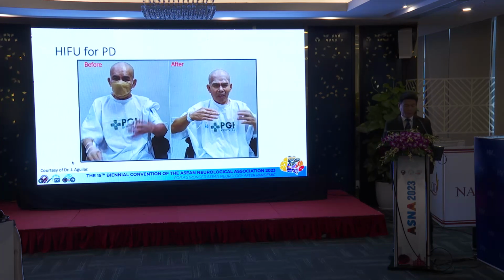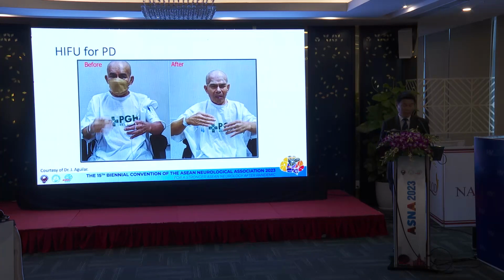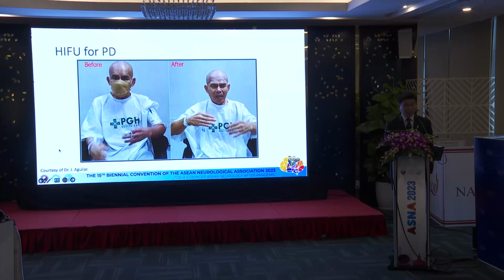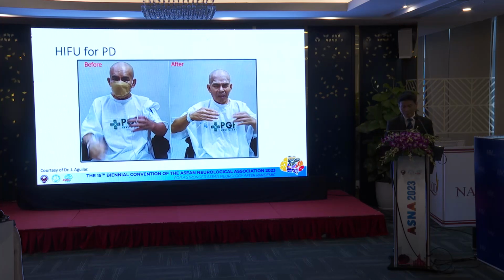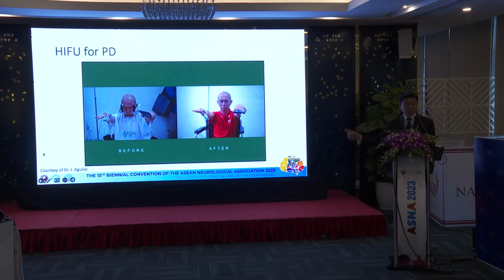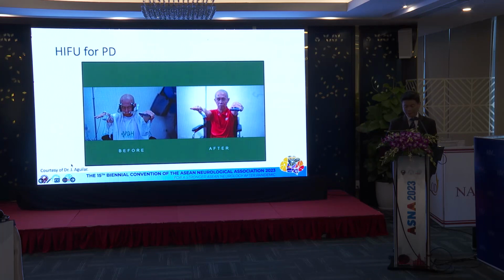So let me show you this particular patient. We did the left HIFU left thalamotomy, and you can see the right hand tremor has completely disappeared. And the beauty of HIFU is that the effect is immediate. Same thing in Parkinson's, the left hand postural tremors have completely disappeared.